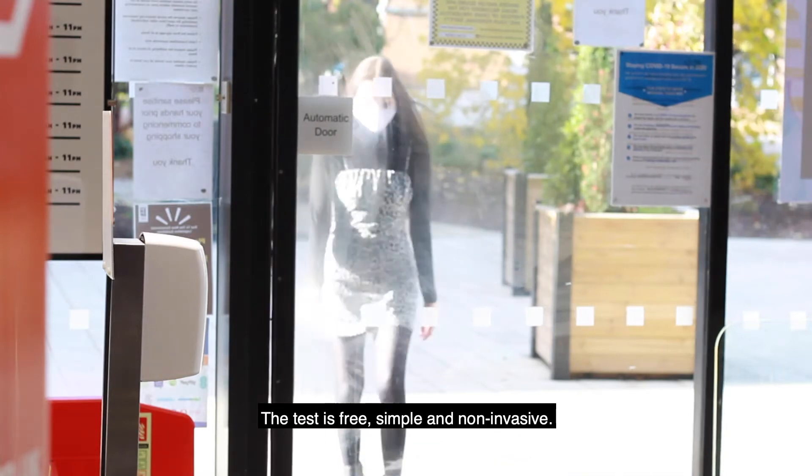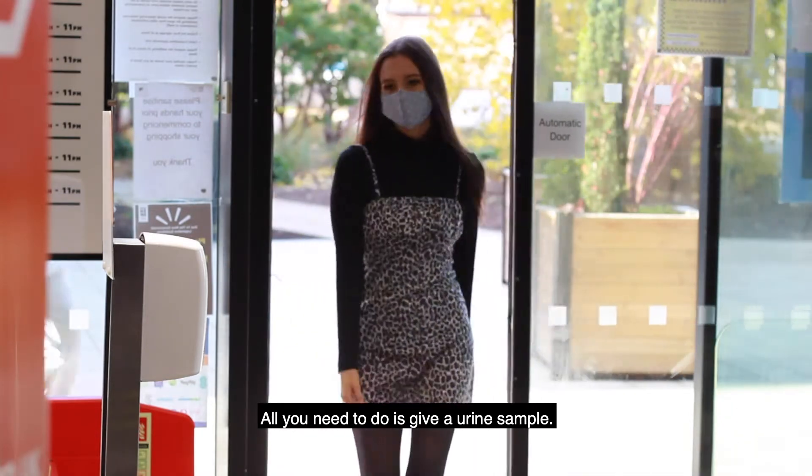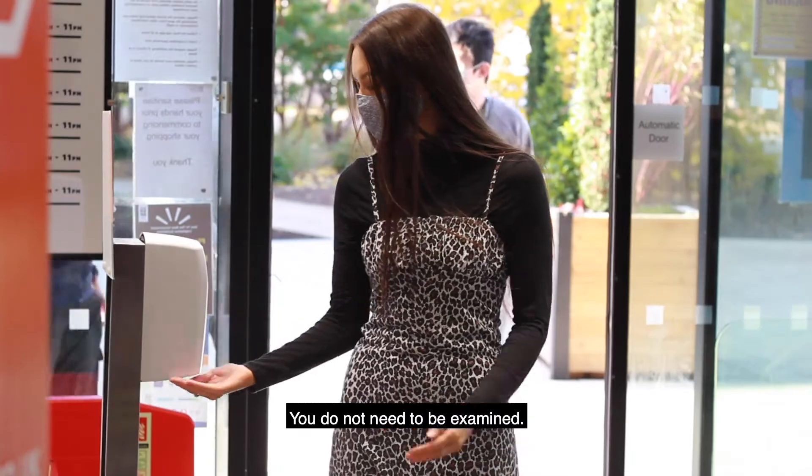The test is free, simple and non-invasive. All you need to do is give a urine sample — you do not need to be examined.